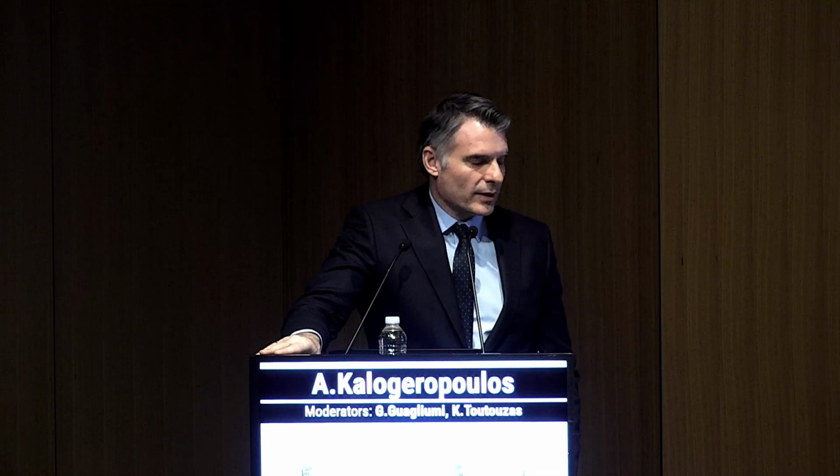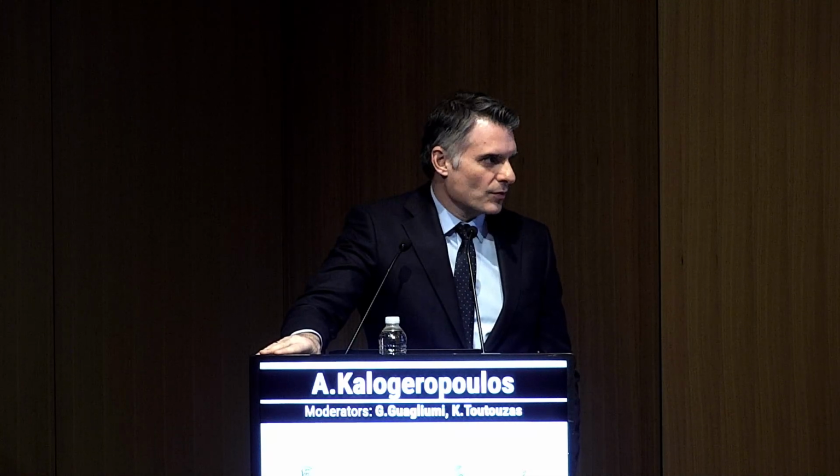Most of the times that's what I do. Secondly, you will never achieve a stent PCI-like result with drug-eluting balloon angioplasty, so you need to get used to that. Otherwise, if you don't feel sure or secure about that, just put a stent.